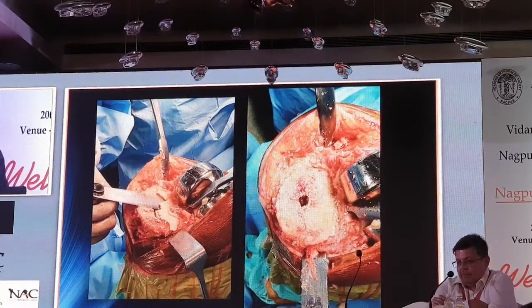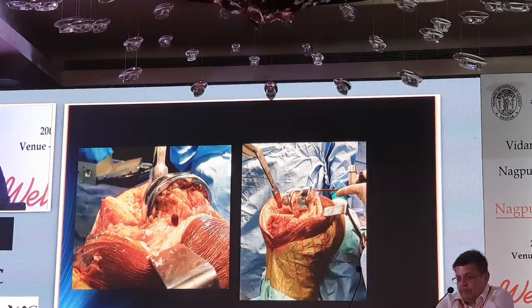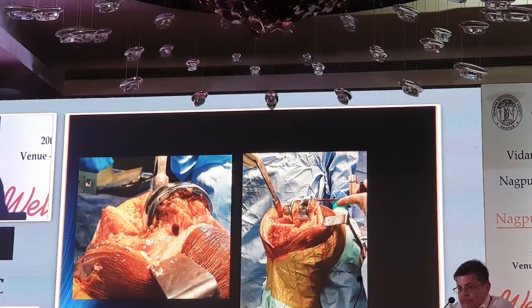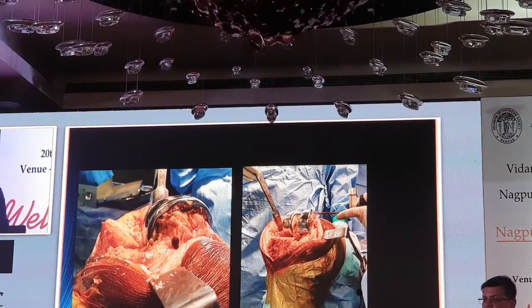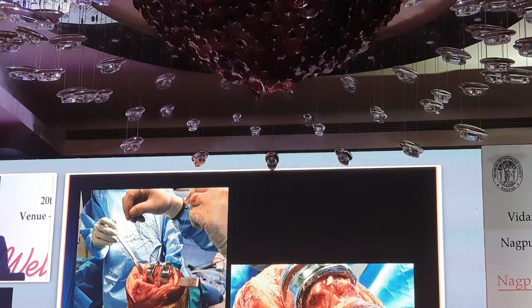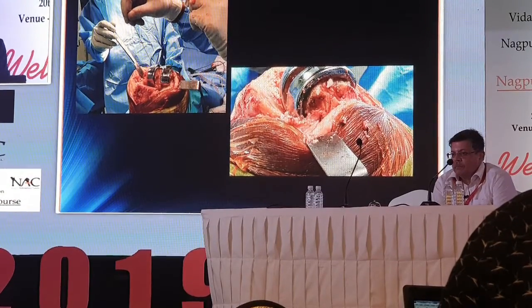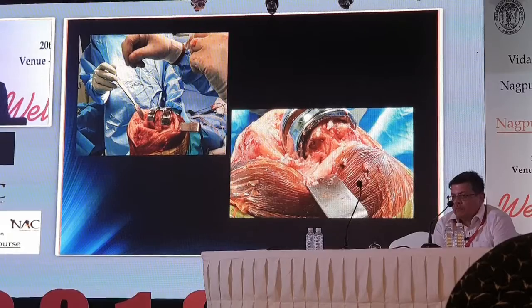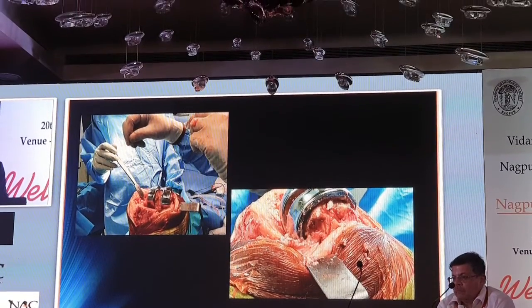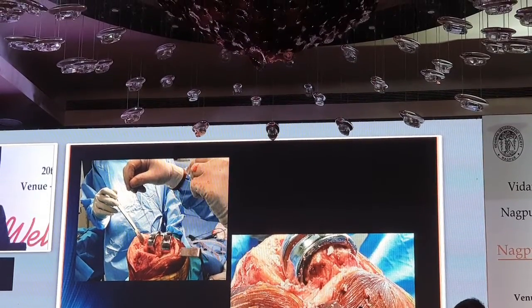Then use the same saw to take a small layer of cement including a little bone to get a nice smooth bone surface. Turn your attention to the femur. Use diathermy to delineate the junction between the femur and femoral component all around. Repeat the step with a small saw. You can use a Gigli saw, which is a very useful instrument, but remember it can cut the femur as well unless you are very careful — your force should always be directed more towards the component rather than towards the bone, because the bone and component are both curved and you can make the mistake of cutting the femur rather than the junction. Once done, you can see a nice delineation between the component and the femur.